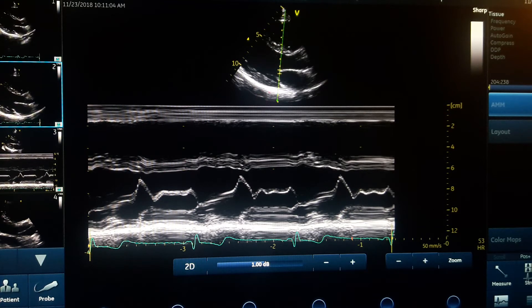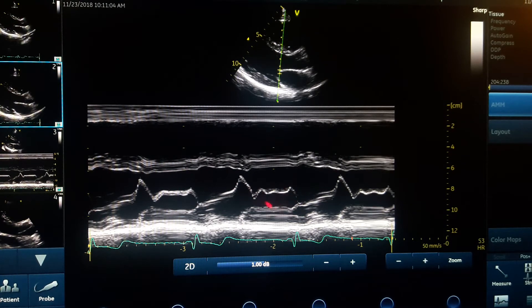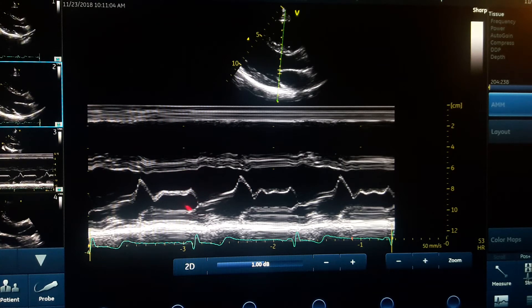When early rapid filling finishes, both leaflets come close to each other but do not close — some blood flow still goes in. Near the end of diastole, corresponding with atrial contraction, we have the last deflection of the anterior mitral valve leaflet toward the septum, with the posterior leaflet going back slightly. Then at the very end of diastole, they come close and meet each other, and the cycle repeats.